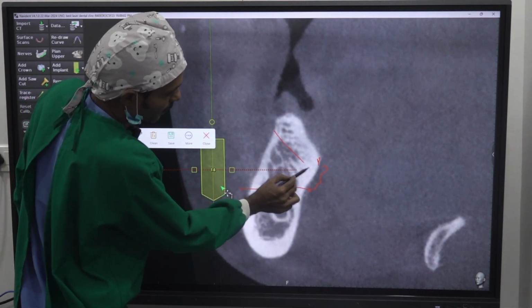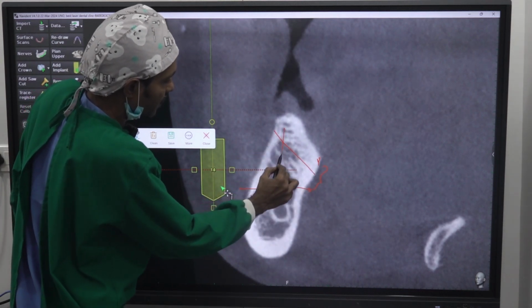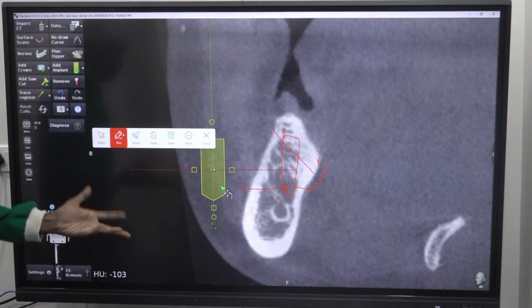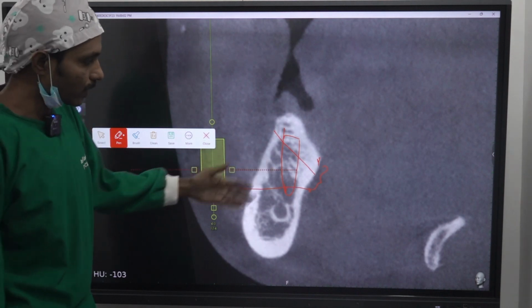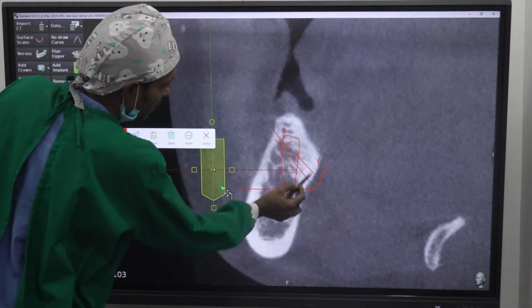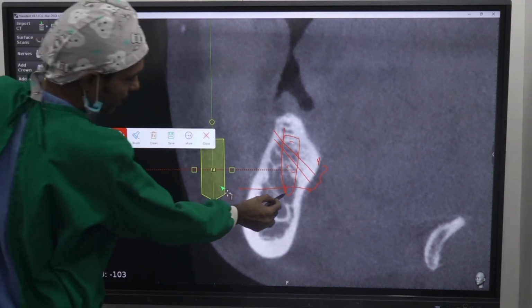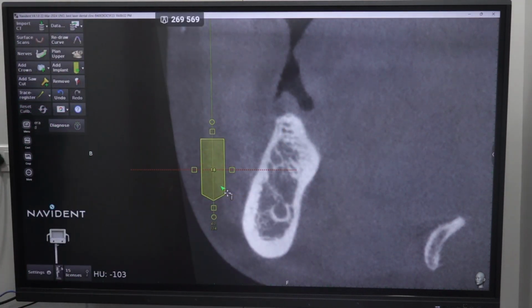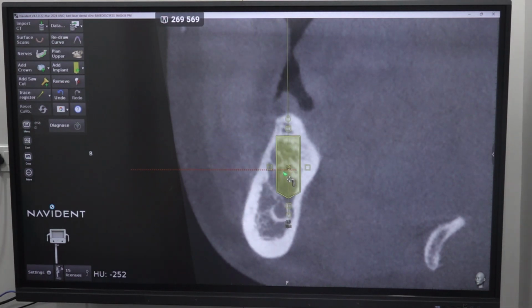Either we can place an implant like this or place a regular intramedullary. I prefer doing intramedullary because the bone here is good. Yes. It will get good stability. Why complicate here? And good length you can still place here. You will see the length. 10 mm we can place. 3.5 into 10 or 4 we can place. Can we do 8.5? Yes.